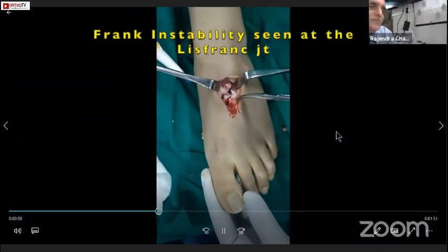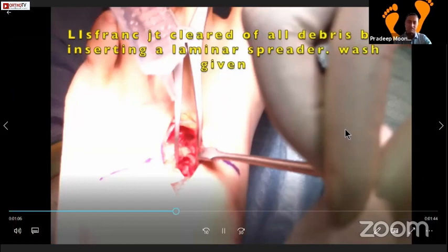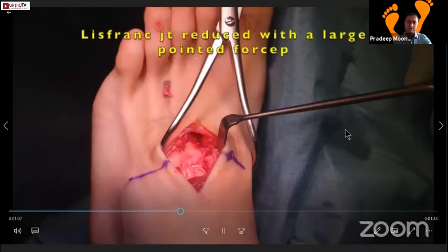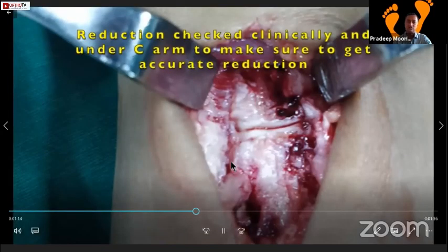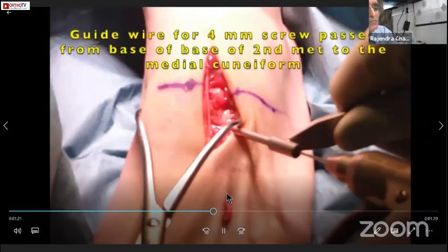You can clearly open it up with a laminar spreader and debride the whole thing - clean up all the small chunks. That's being cleaned up as well. This is a towel clip which you can attach to reduce it - one on the medial side and one on the lateral - and check for reduction. You can clearly see the reduction here, and this line reduces as well.